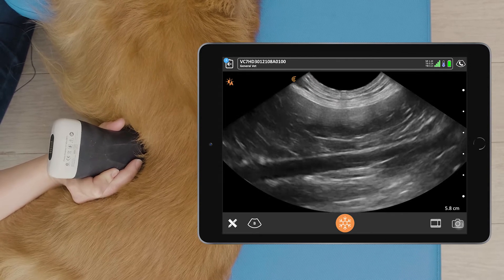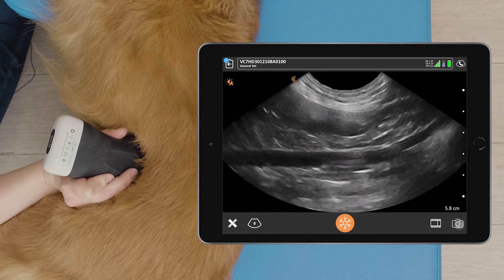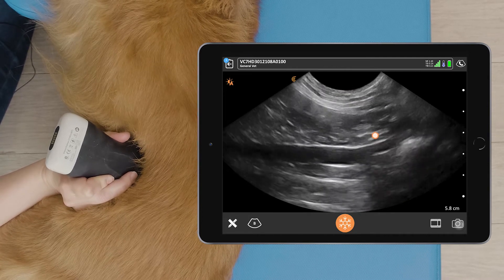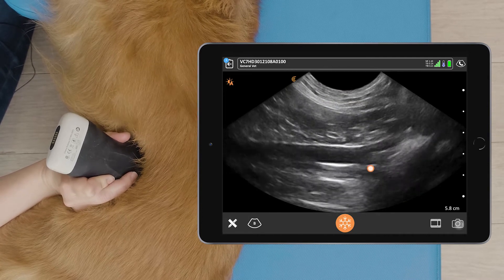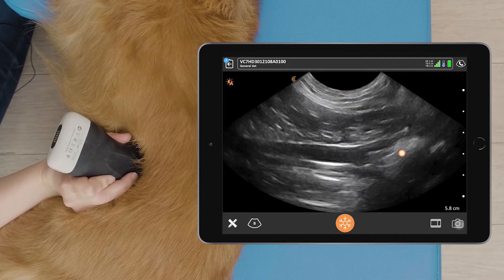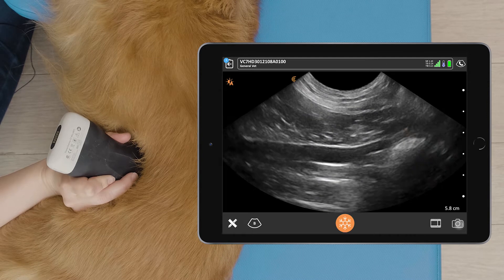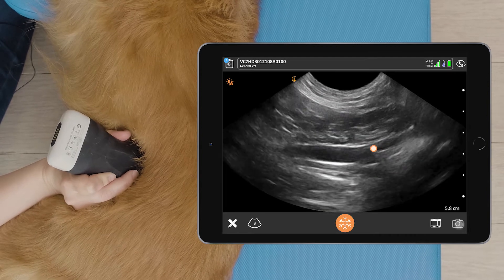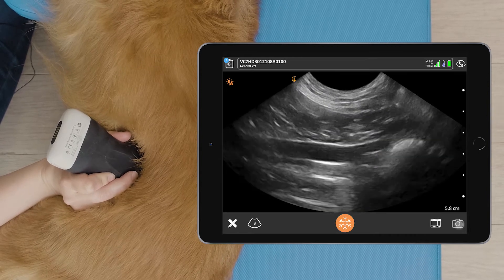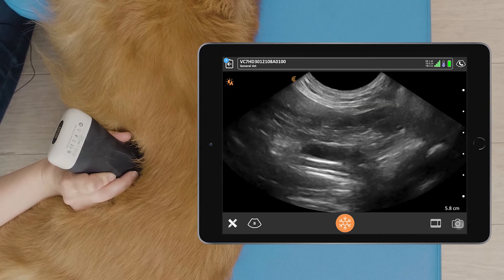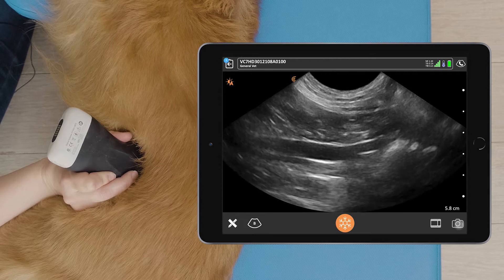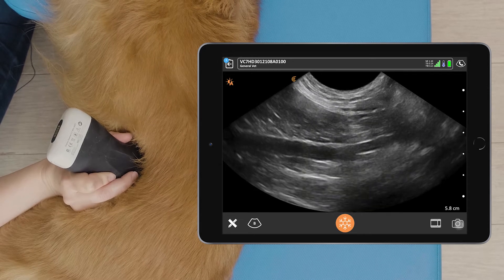We can follow that tube cranially until we get to the aortic trifurcation. Here we can see the external iliac artery leaving the aorta, and we've got the left branch here.